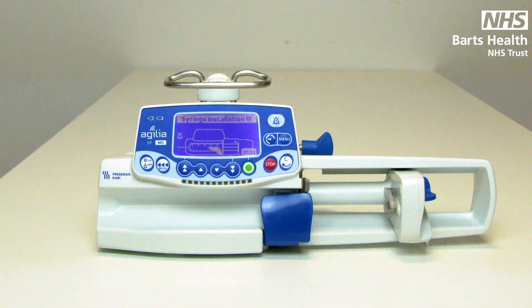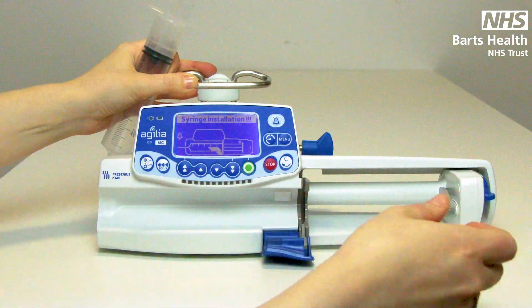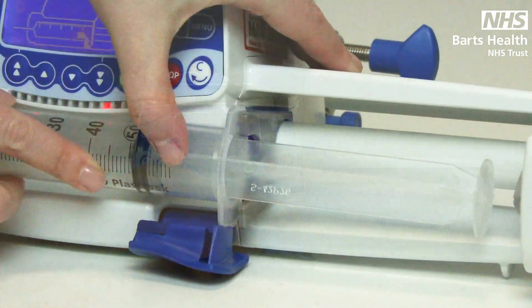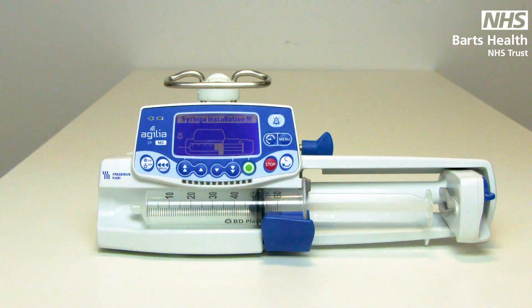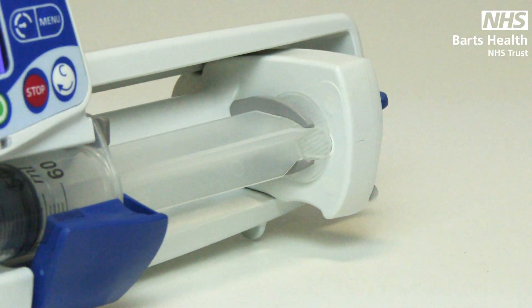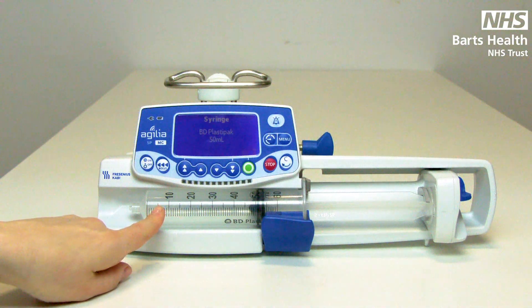The pump will show a pictogram to aid in the insertion of the syringe. Release the barrel clasp and take the plunger to the end. Line up your syringe wings with the grey cradle and insert. Lift the barrel clasp to secure. You will notice this has stopped flashing. Then pinch at the end and move the plunger to the end of the syringe and secure in place. Then you need to confirm the syringe brand and size. The pump will take from 50ml down to 5ml syringe sizes.